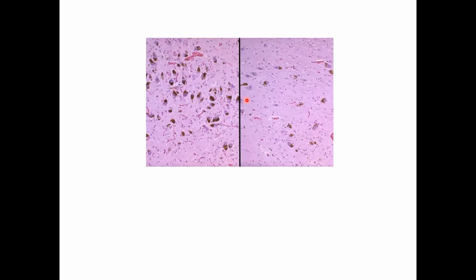Another picture of Parkinson's disease كمان. This is the normal. شايفين how much there are pigmented neurons. كل هدول اللي جواهم بني are neurons that contain pigment. Compare, this is the brain of a person with Parkinson's disease. ما في pigmented neurons كتير.